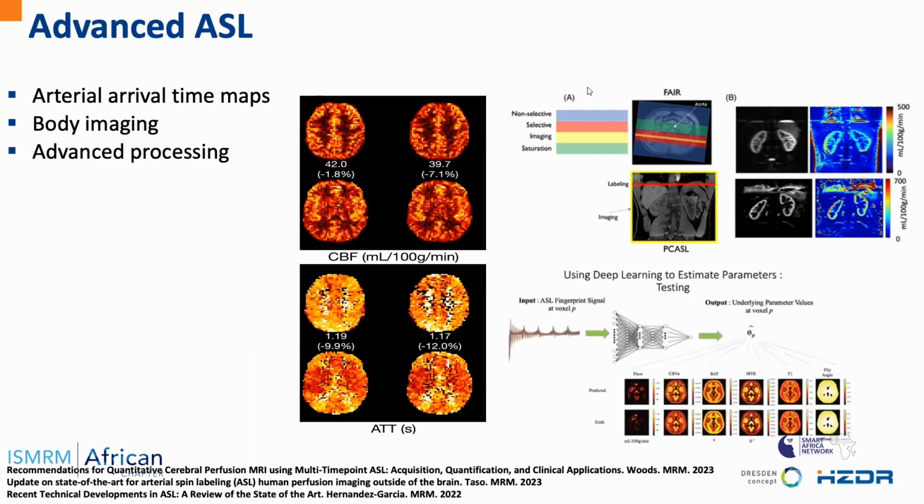And there are many new advanced processing techniques to process the ASL data and derive new information from that. So if you're interested in these advanced techniques, then I invite you to read these 3 recent excellent reviews.